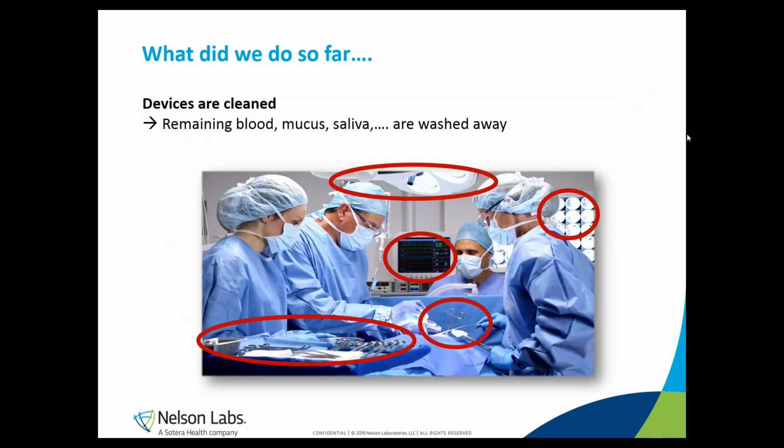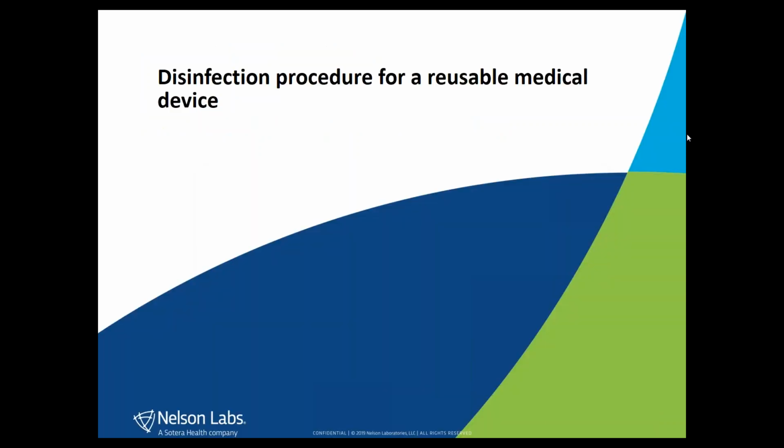So just to summarize, what did we discuss so far? We have validated a cleaning protocol to be used for a specific device and proved that any residue that remains on the device after performing that cleaning procedure is within acceptable levels. So we are now able to wash that device and wash away any remains of blood, mucus, saliva, or anything else. Okay, now the devices are cleaned, they are ready for the next step.